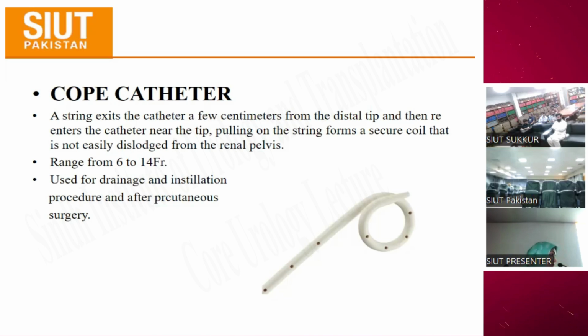It doesn't depend upon the length of stay of the stent inside the system, but rather it depends upon the actual patient and the actual metabolic as well as bacterial load of the urine which the patient or the system is carrying. So ये चीज़ें आजकल के ज़माने में याद रखिएगा.